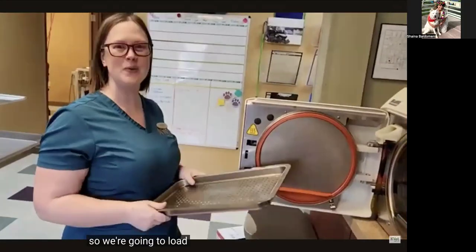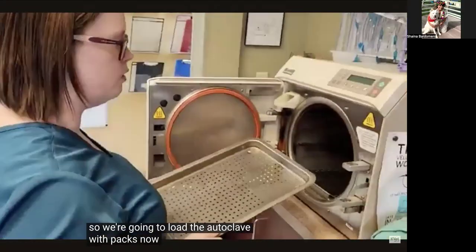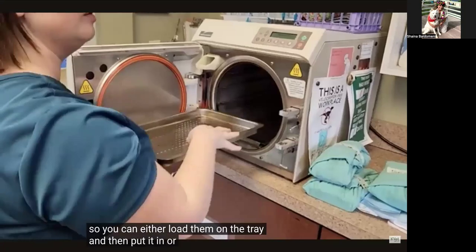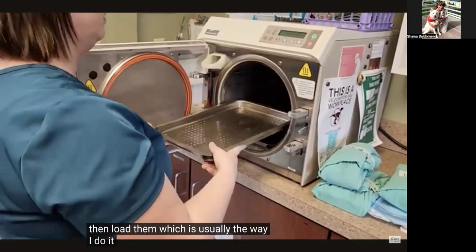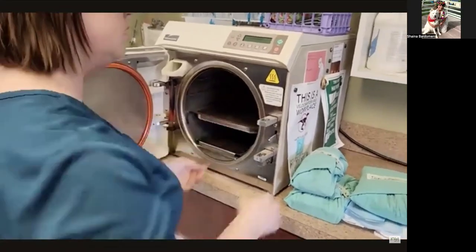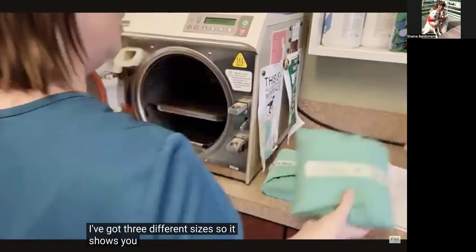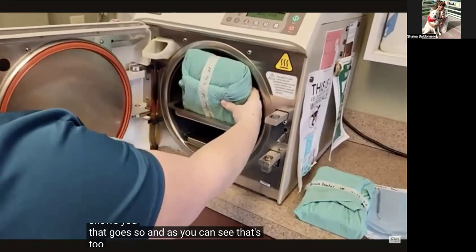So we're going to load the autoclave with packs now. You can either load them on the tray and then put it in, or put the tray in, then load them, which is usually the way I do it. I've got 3 different sizes, so it shows you how that goes. As you can see, that's too tall at that setting.